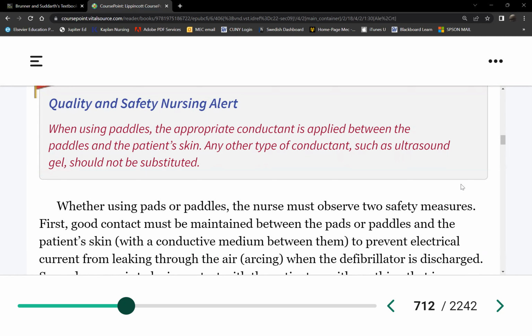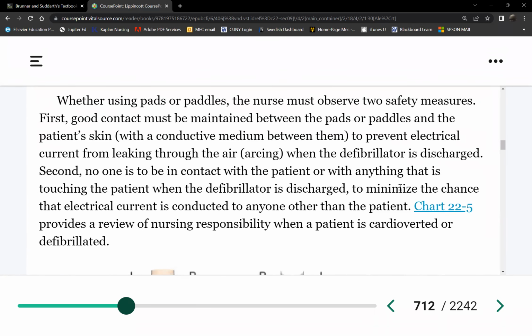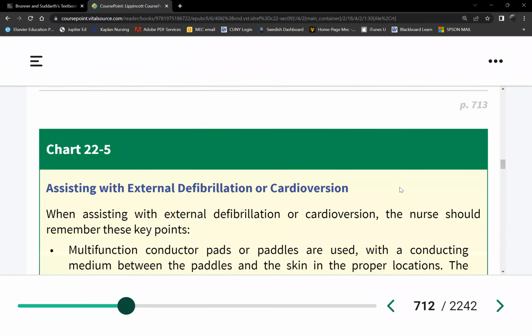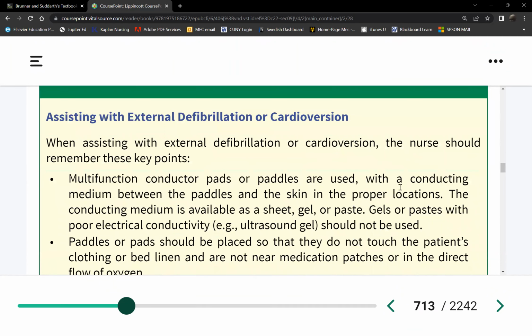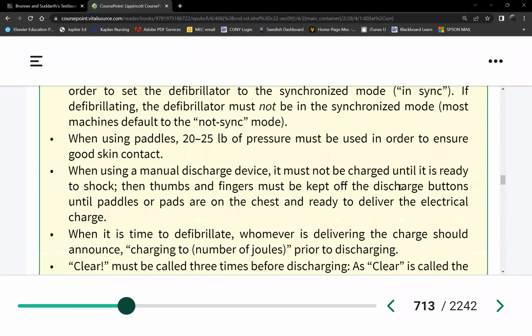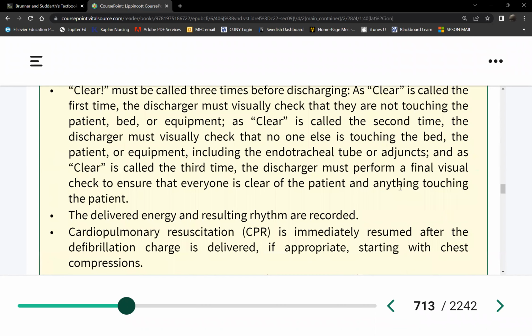You know how to use the AED, so I assume you know what to do before you press the button. What do you do first? Okay, make sure everybody is not touching the patient. You have to shout clear though, including yourself. You may be shouting clear, but you're the one touching the patient. All right, here's the reminder. This is already part of your BLS training, so just please make sure you review this.